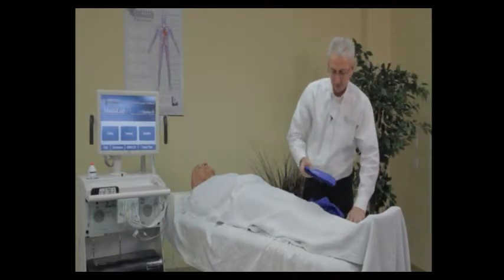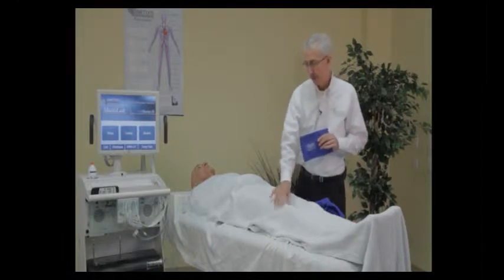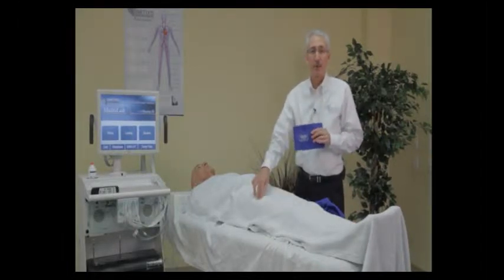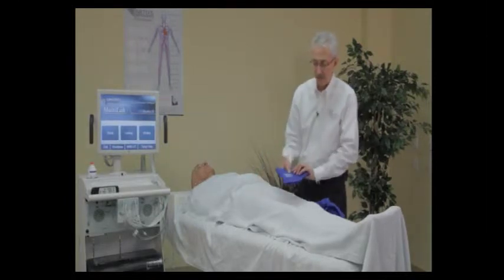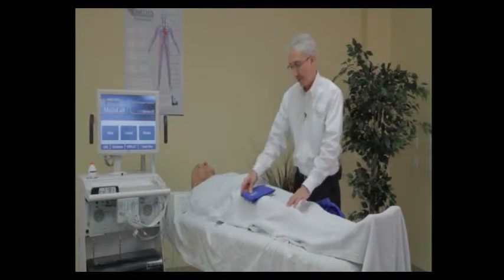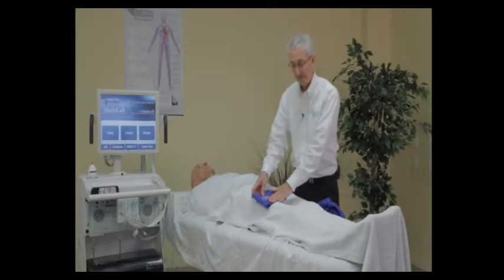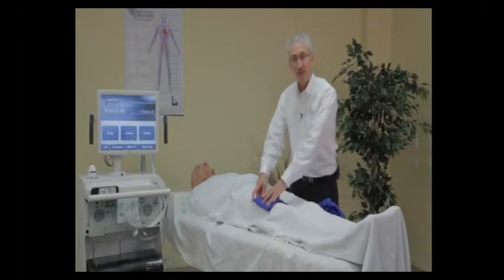Next up we have the 12 centimeter cuff. The 12 centimeter cuffs are commonly used above the knee and at the high thigh site if you're doing a four-cuff study. If you are going to do a four-cuff study, make sure there's enough room to get two cuffs above the knee without them overlapping in the middle. If they overlap or are over the kneecap, consider using one cuff at mid-thigh.